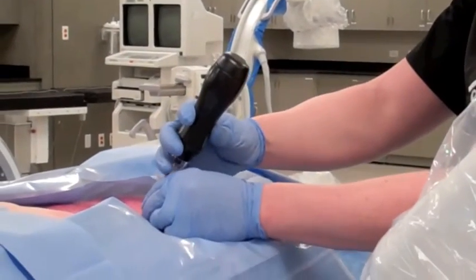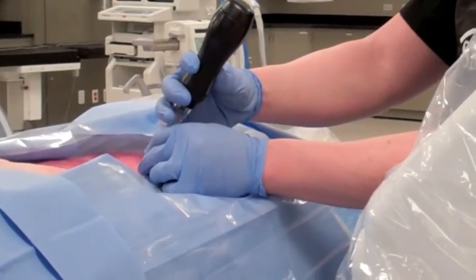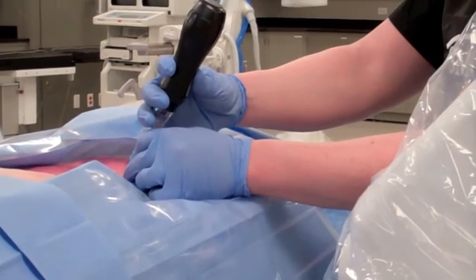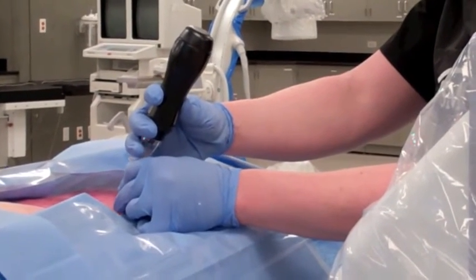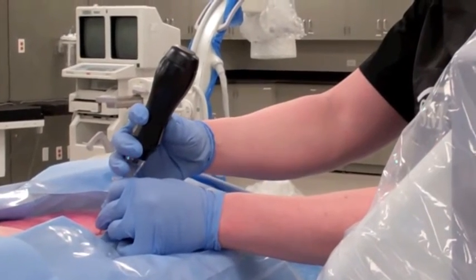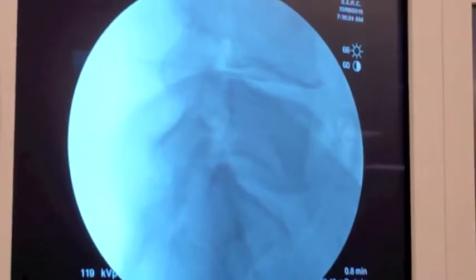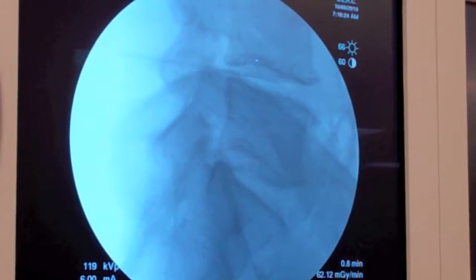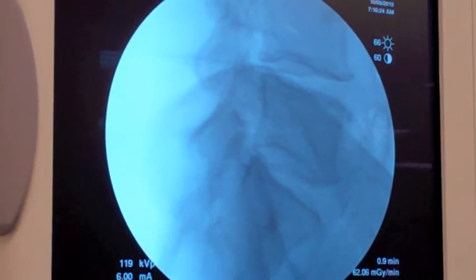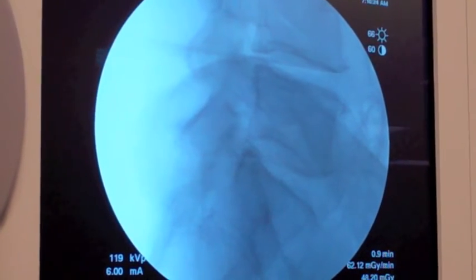Then I will pass back and forth as I go live. I'm watching with x-ray guidance as I go back and forth inside the disc to take out material. You can see my needle advancing and withdrawing as I make multiple passes through the disc.